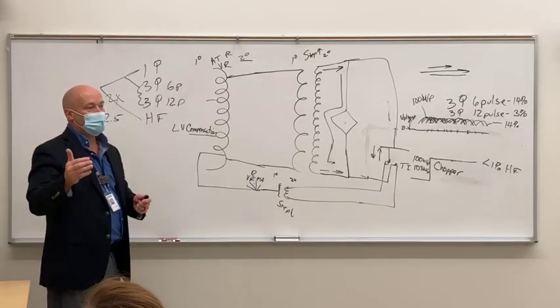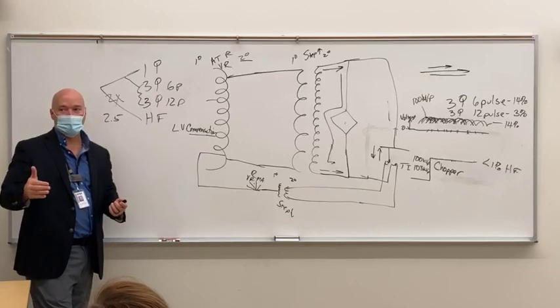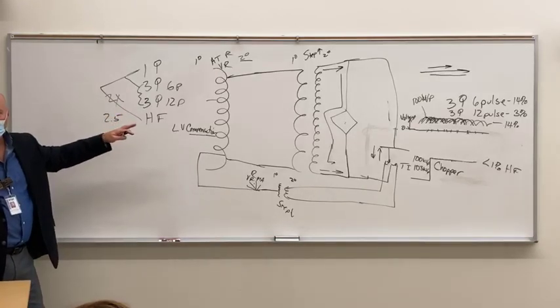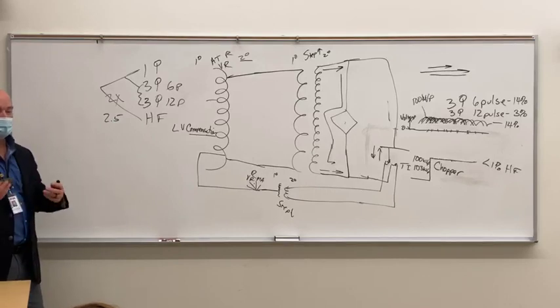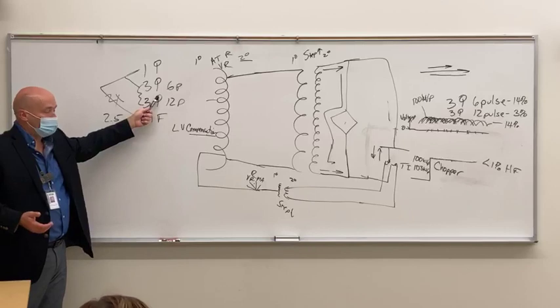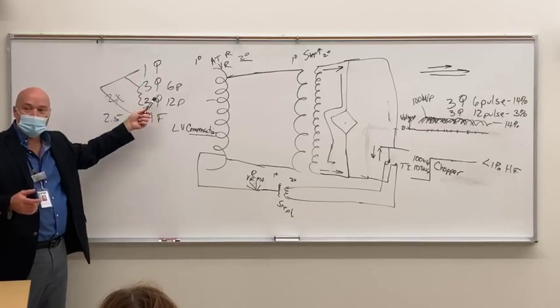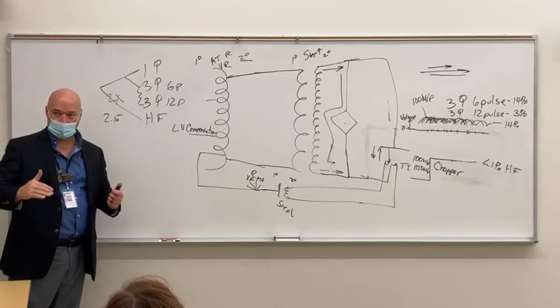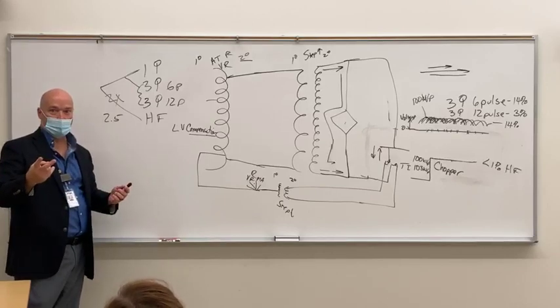You're going to struggle with this, I'm going to tell you now, all the way through your second year, okay? Even though you're probably never ever going to see this, you still got to know it, and you're going to struggle with it all the way through the second year. If you go from single-phase to three-phase, then your output increases, which means you need to decrease your technique by a factor of 2.